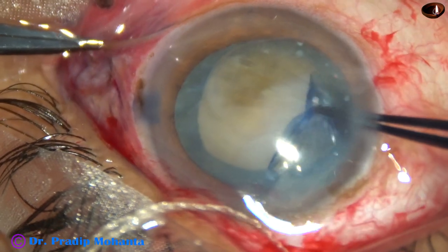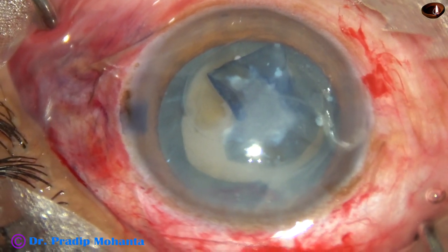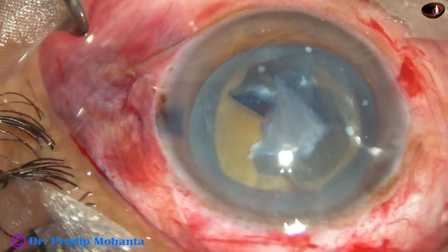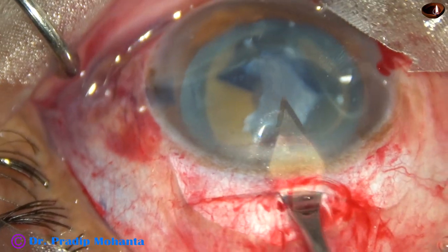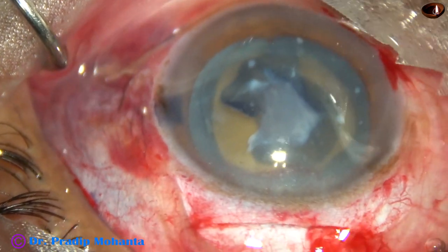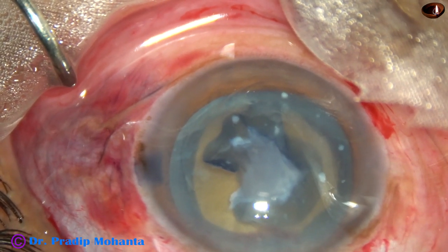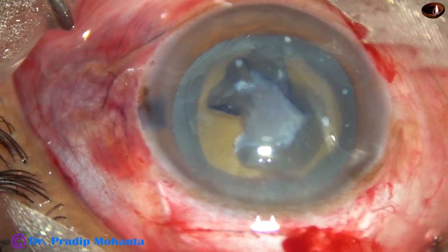So this is a very tough case, even for phacoemulsification — this is a very tough case. The capsulorhexis is done. Now I am going to open the tunnel completely. The tunnel has been opened only on the right side; now I am going to open the tunnel completely from one end to the other end. The length of this tunnel is about 7 mm. In hypermature Morgagnian cataract, the nucleus is usually small, but you never know — it can be very large also. In this case, the nucleus is of moderate size.